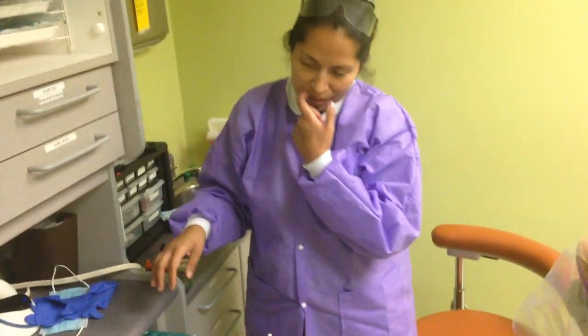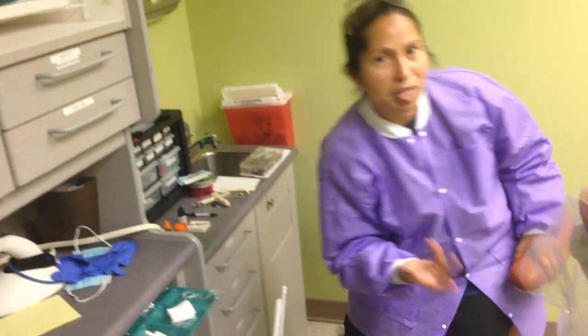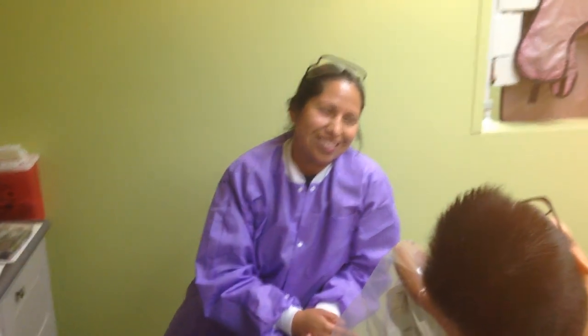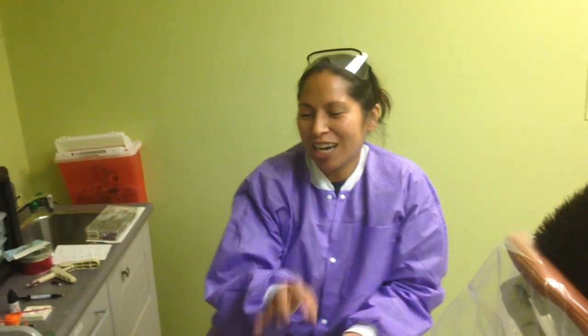When you begin the filling, the doctor's going to come in and put numbing gel in, then anesthetize the area. For the bottom one, it's always going to be that the bottom has that long nerve that has to be injected at the very back. On the top, each individual tooth that has to be numbed is done separately. She's going to numb the area.